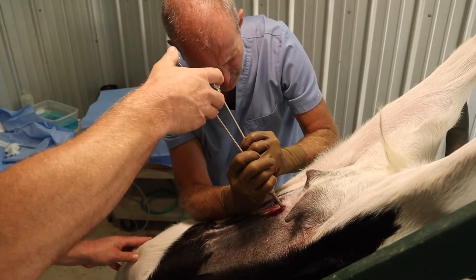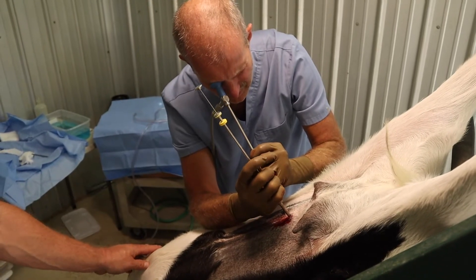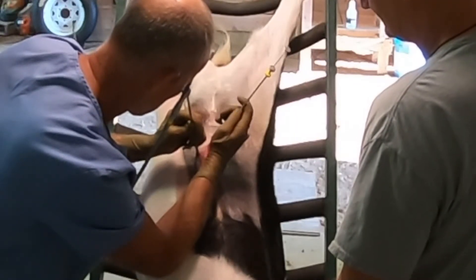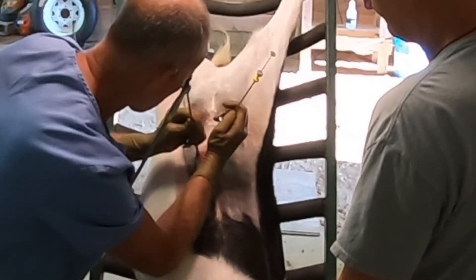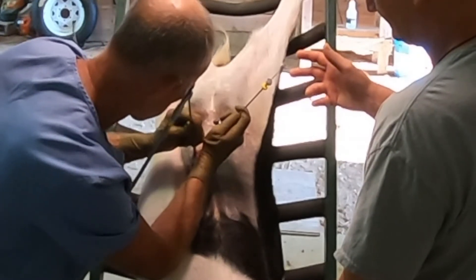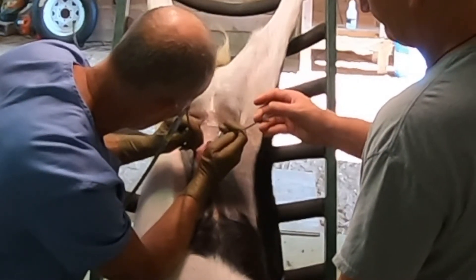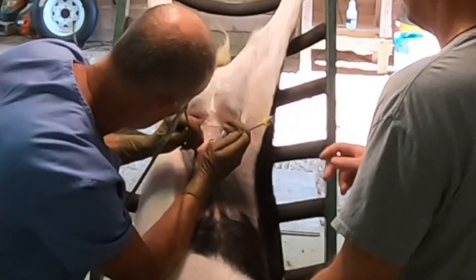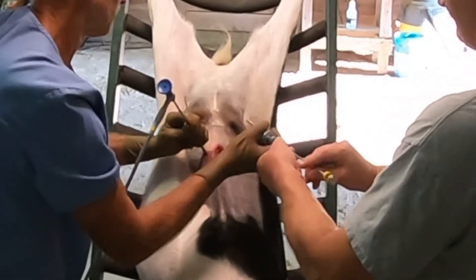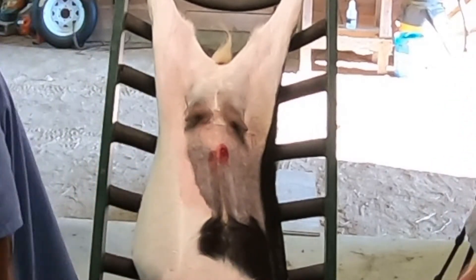I've just entered one uterine horn. We're going to inject the semen into there. We'll come back out and insert the needle into the second uterine horn. And we'll deposit the remainder — just slide that out. Awesome. Insemination complete.